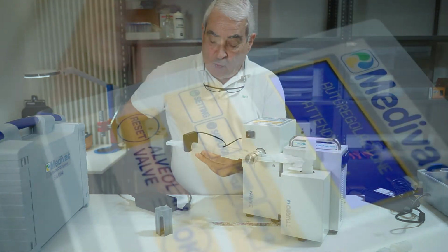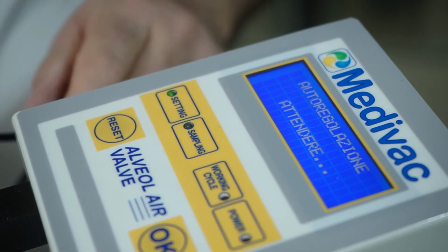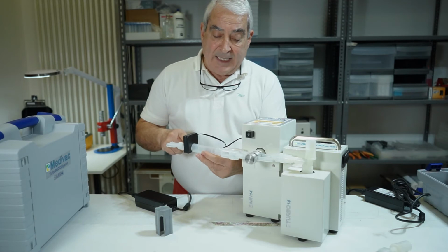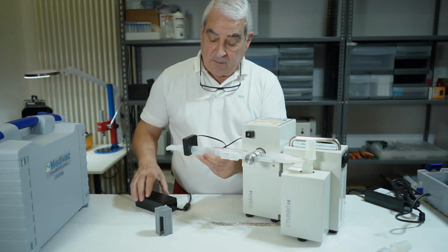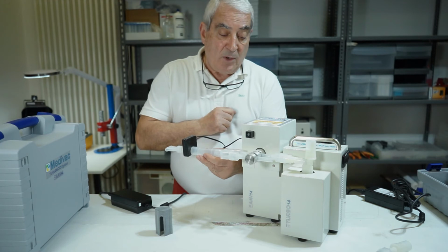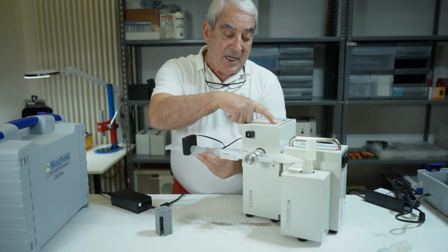Pressing the OK button on the control panel, we start the self-calibration based on the CO2 concentration in the circuit. The calibration time takes 20 to 30 seconds. When we hear the beep, it means that the self-calibration is ended, and therefore, pushing the OK button again, we can start the sampling.